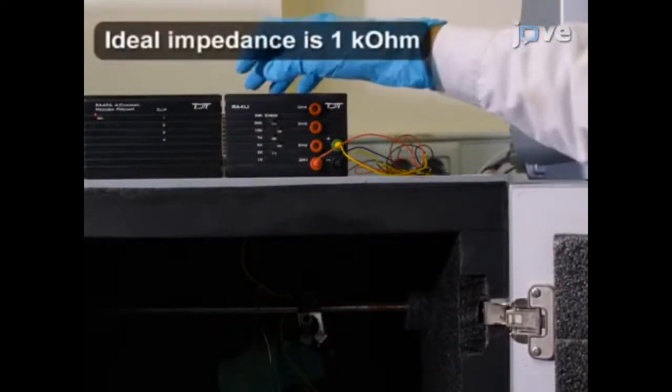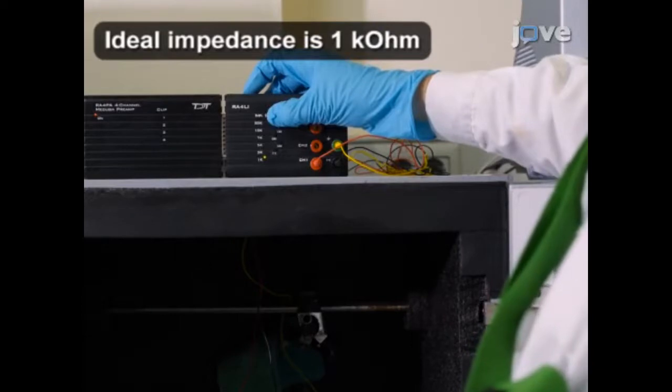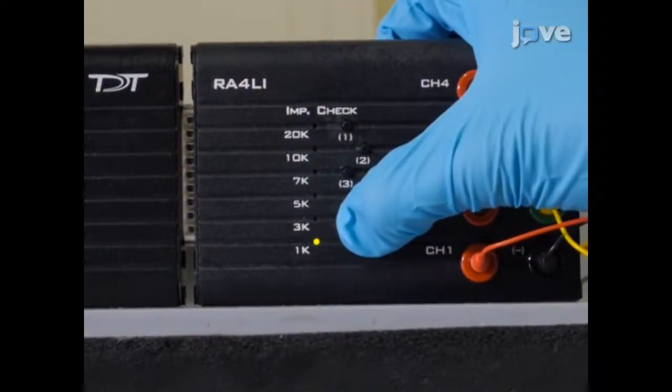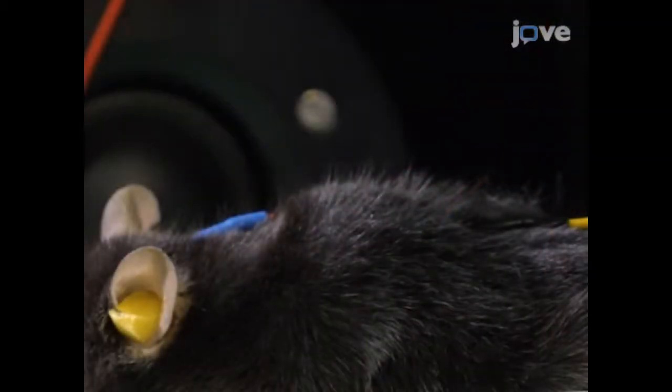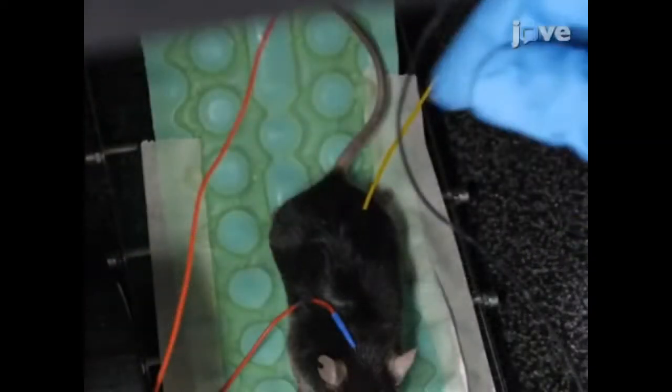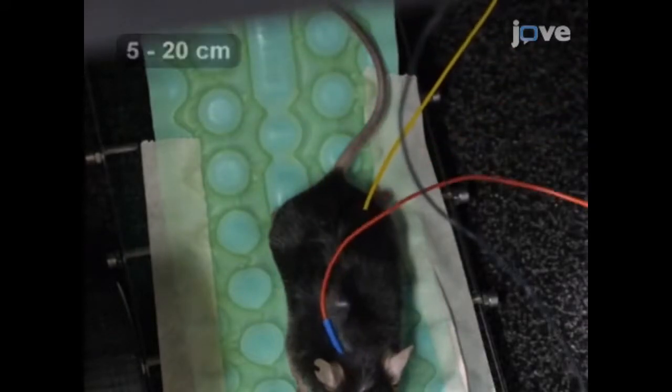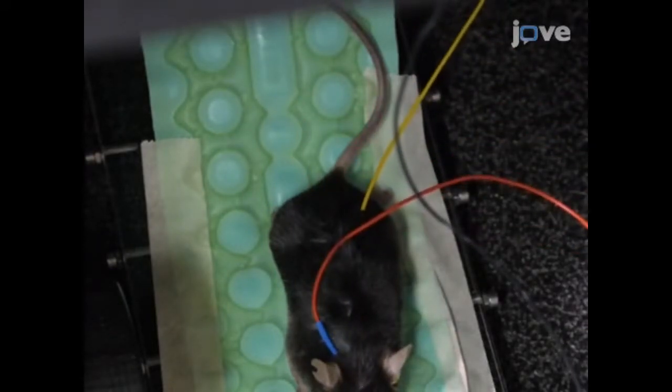Check the electrical impedance in the positive and negative electrodes. Ensure that the impedance is less than 3 kiloohm. Place the free-field speaker at a fixed distance facing the selected ear, with the center of the speaker aligned with the external auditory canal. Ensure that there are no obstacles between the speaker and the ear and that the pinna is completely opened.